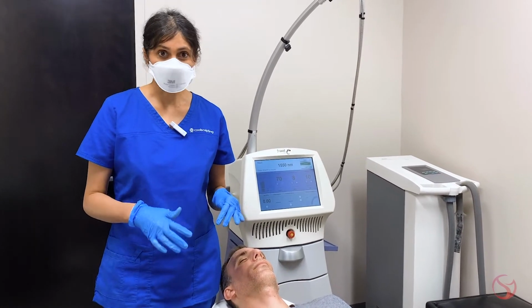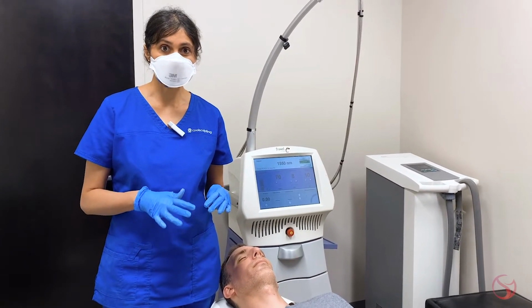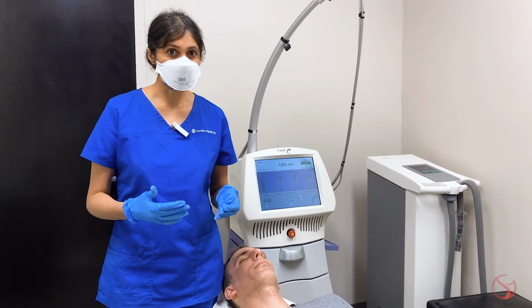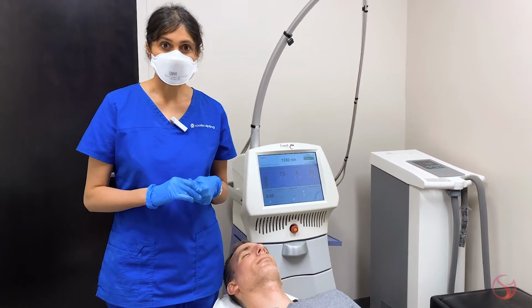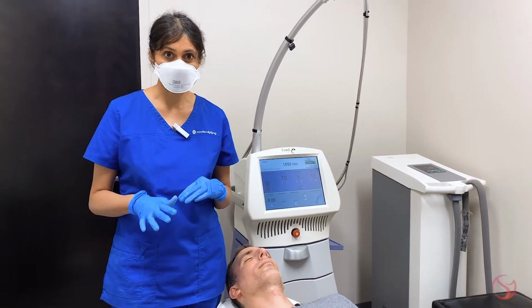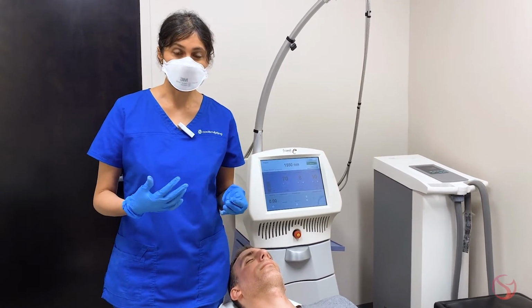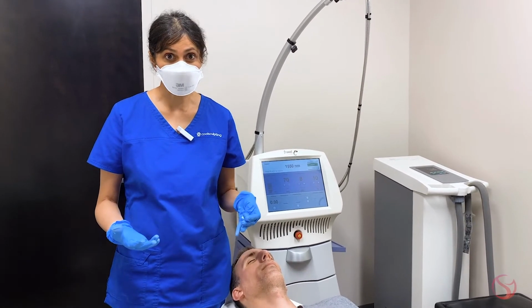It's not the best for brown spots or facial vessels, but we do see an overall reduction in redness in the skin, which is really nice for patients who might have rosacea or flushing. And it does help with that, even though it's not a vascular laser. We do see some reduction in pigmentation. But if somebody has more sun damage in that regard, we might combine it with a different laser like BBL.